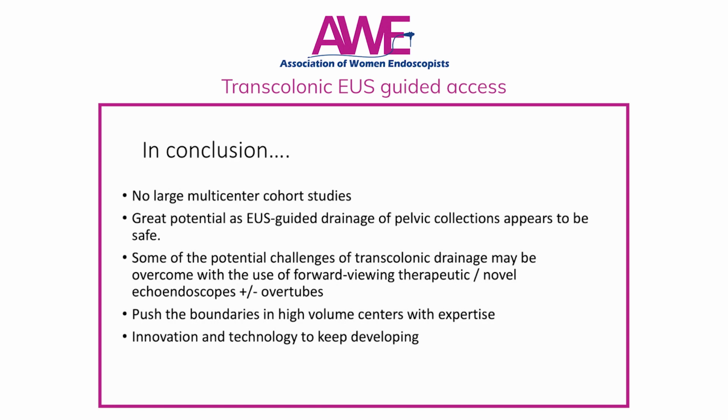But we need larger studies. Some of the potential challenges of the transcolonic drainage may be overcome with the use of the forward viewing scope, and we look forward to more novel echo endoscopes, and of course, we could try with overtubes as well.